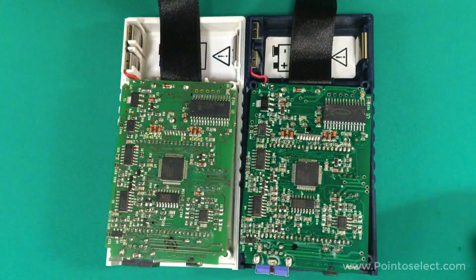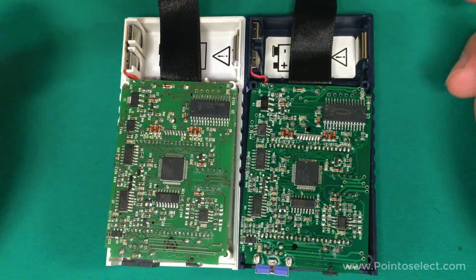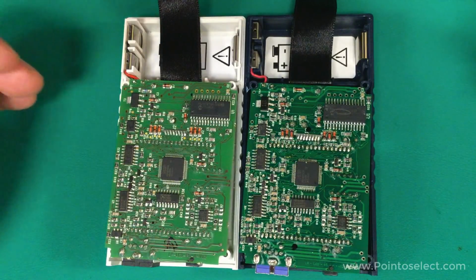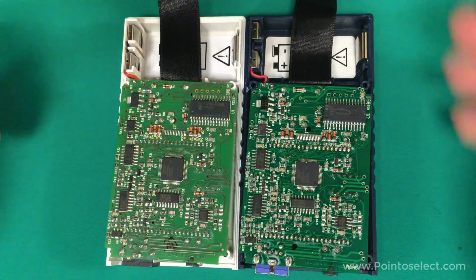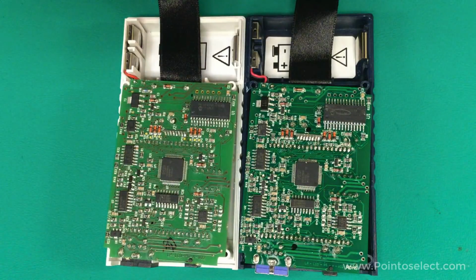Now, you'll notice the circuit boards are different colors, and that's probably because getting circuit boards made is kind of a commodity thing. There's lots and lots of circuit board factories. You give them your design, they make your board, they hand it back to you. And so these were either made at different factories to the same design standard, or they were made during different runs at the same factory. I know for a fact originally all these units were made at the same factory, and I don't know if they still are or not, but clearly it's the same design. We've got the same sticker there. It looks like in every respect they're building them exactly the same way.